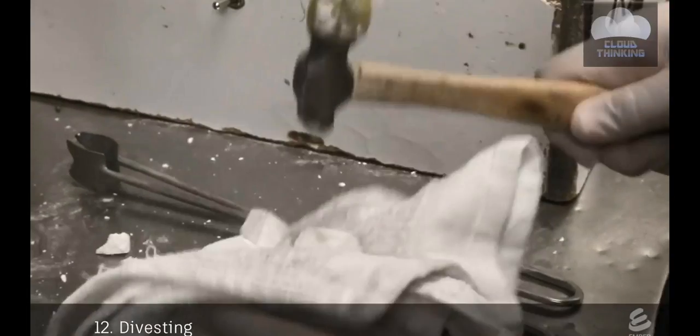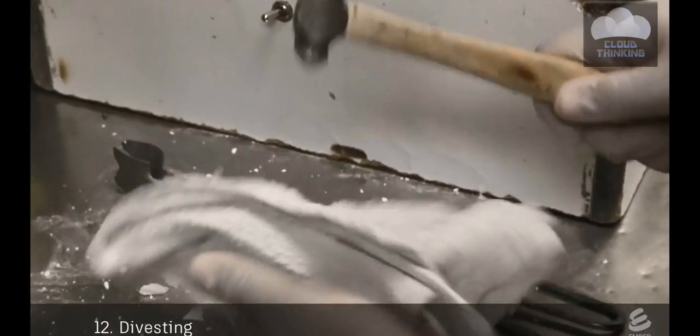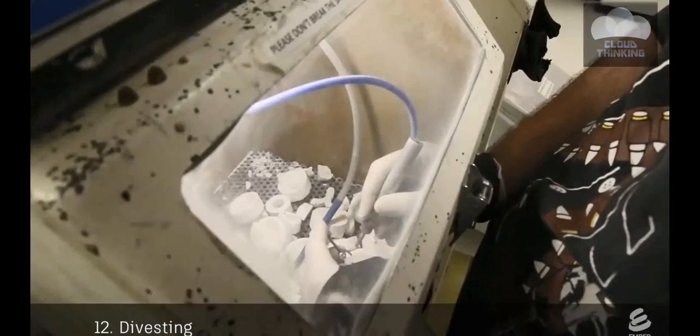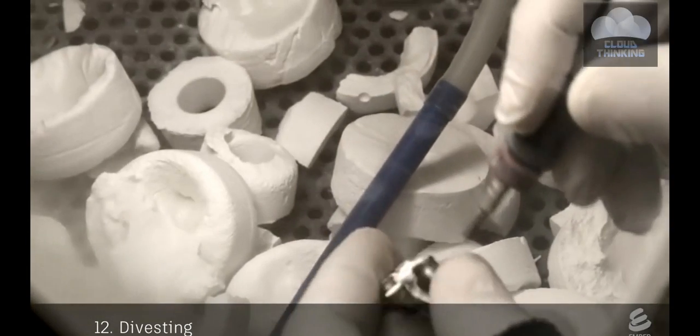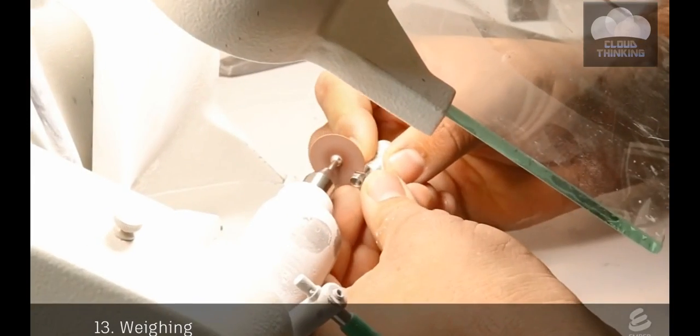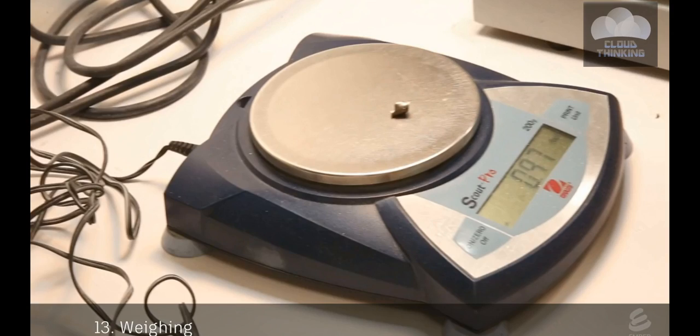In a process called divesting, a technician breaks apart the investment with a hammer and uses an air gun to remove any remaining pieces of investment. He cuts off the sprues and weighs the castings to determine the price.